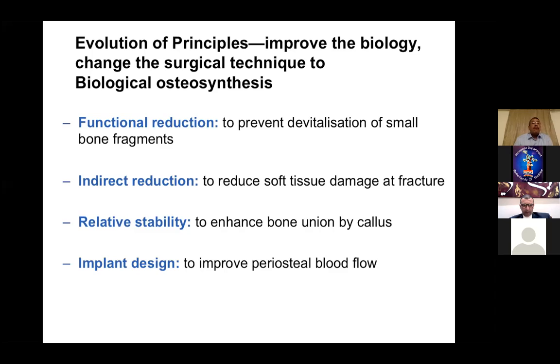And there are many developments and changes to improve the implant design in order to avoid the drawbacks of the standard or classic plates, to improve the periosteal blood flow underneath the plates and to manage the drawbacks of the conventional DCP.